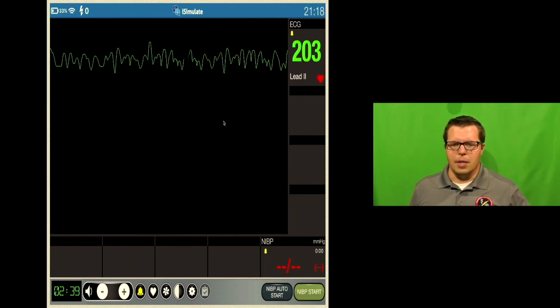Otherwise, all you'll have on the ventilator and the monitor is one piece of the puzzle, and there are 2 more pieces, namely the patient's bicarbonate and the patient's pH, that are critically important to know before you go monkeying around with that. So be warned, be cautious if you're going to fix a low end-tidal CO2 in most of these patients.